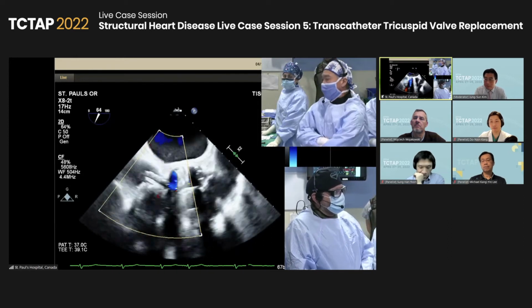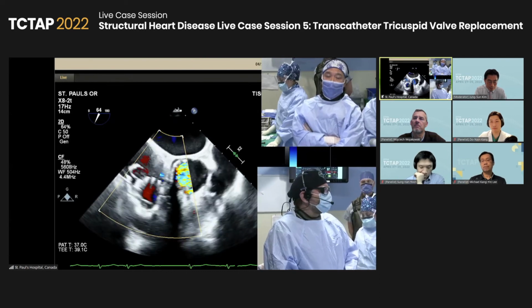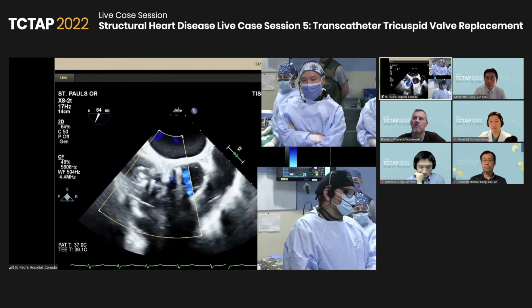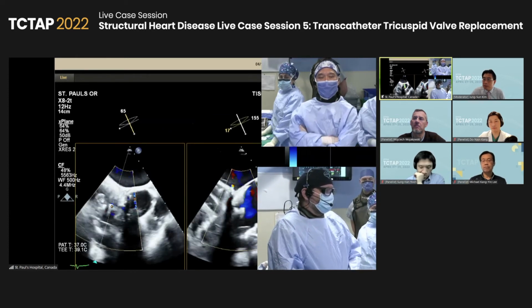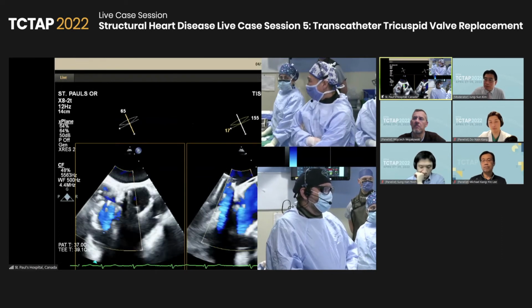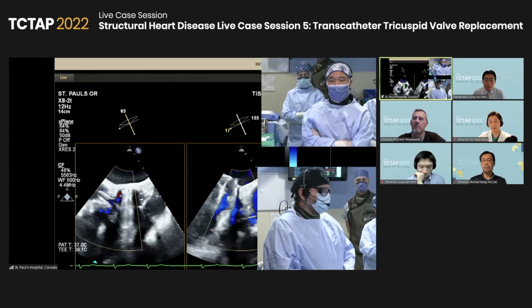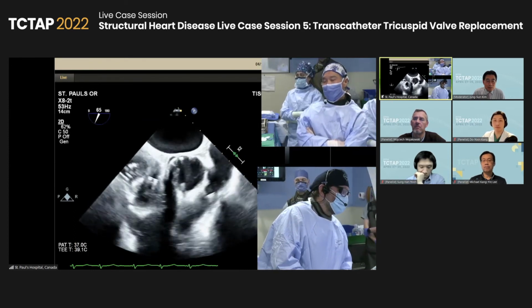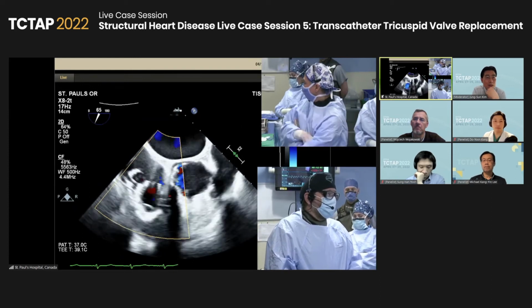Another important thing is that a good portion of the patients we have done so far had pacemaker leads going through the valve. One danger with anchoring any device is having those leads interfere with the anchoring mechanism. On CT, we also look at where the septal tongue is entering and whether that would be a problem. So far, we haven't encountered a patient who is not suitable for this particular device. Anything to add, Rob?